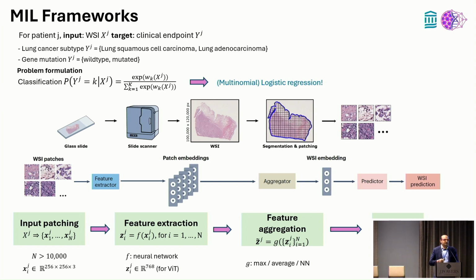But we also can extract features from these individual patches and then train a model on top of those features. In the beginning, we were just using a ResNet that was trained on ImageNet, using those features to see how well this can perform. More recently, this has been replaced by lots of self-supervised models, commonly now referred to as foundation models.